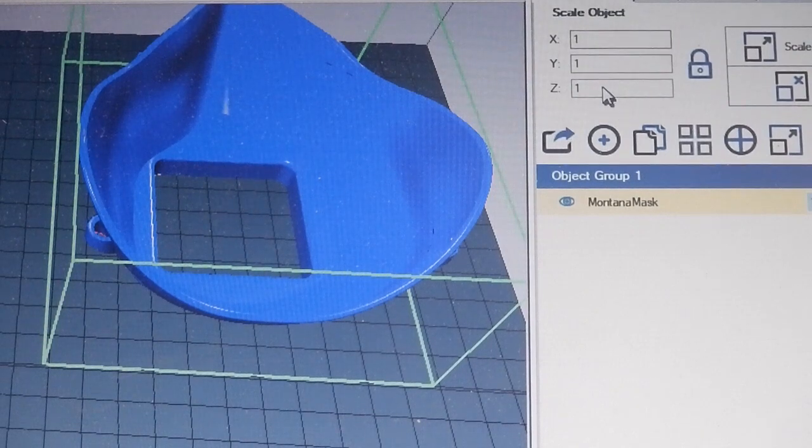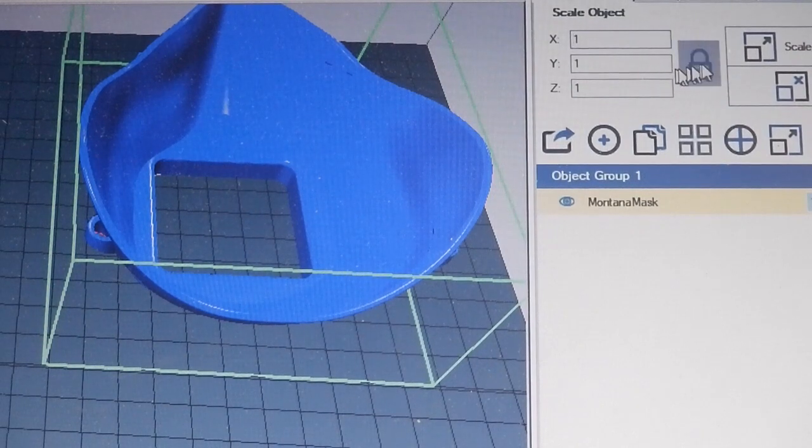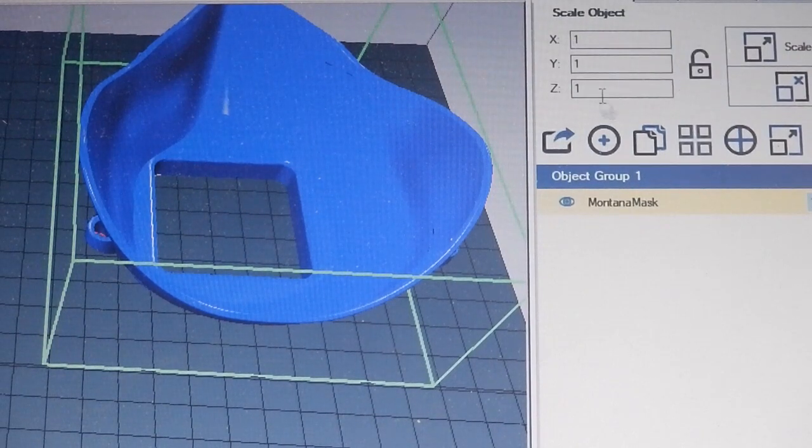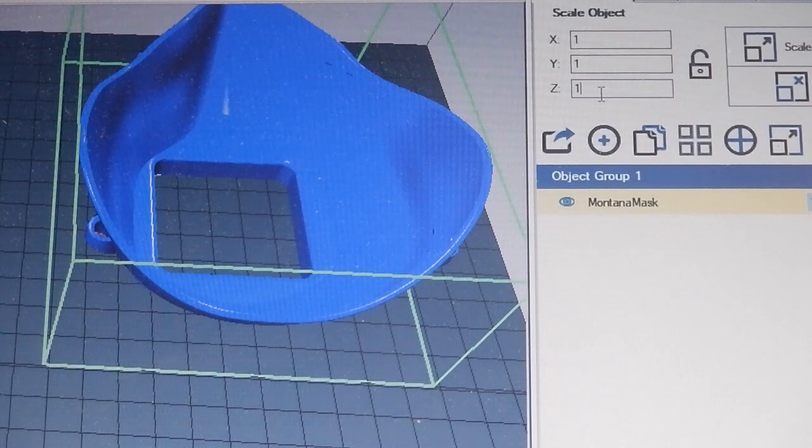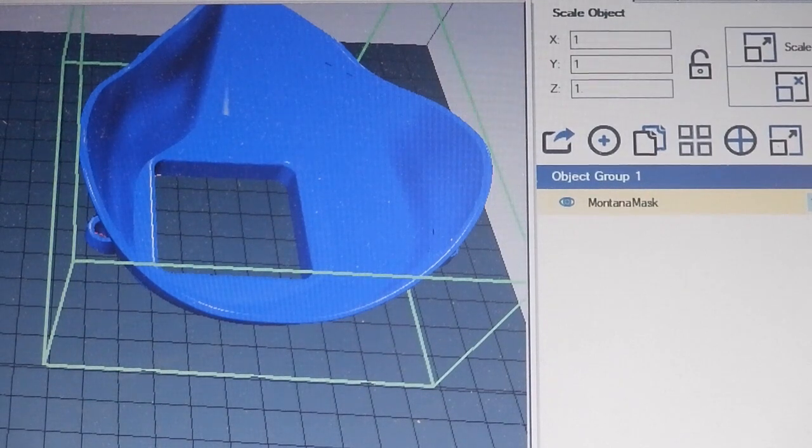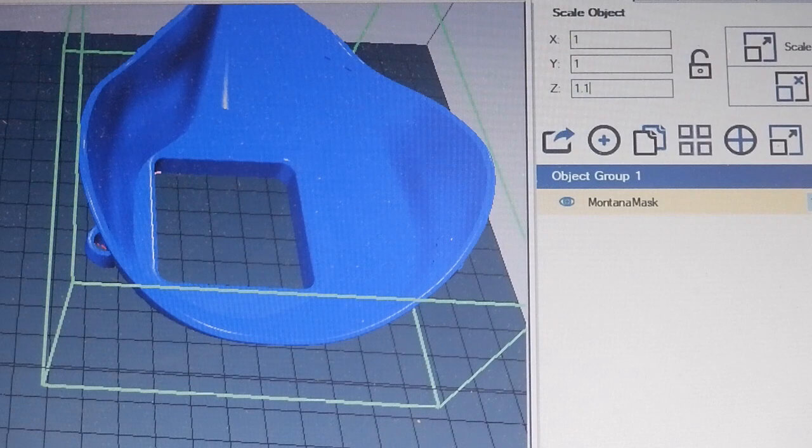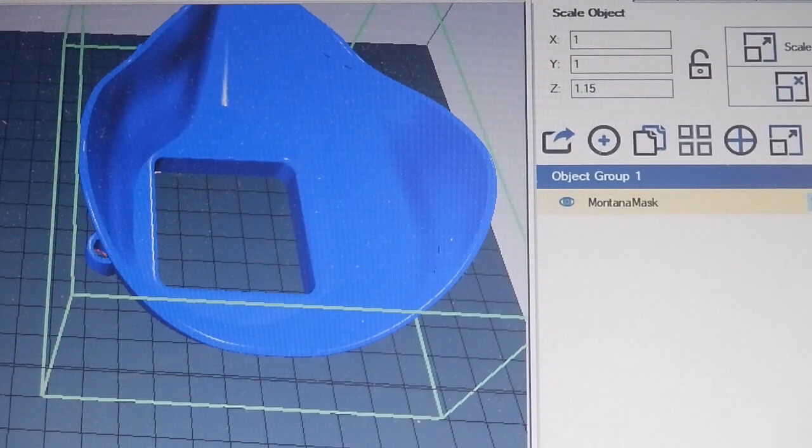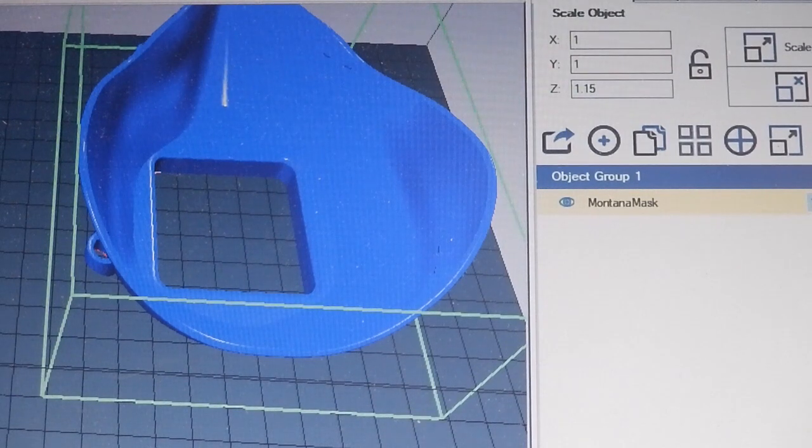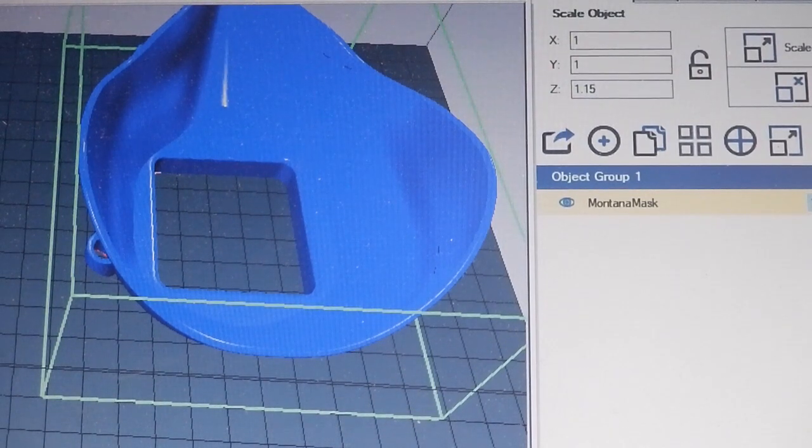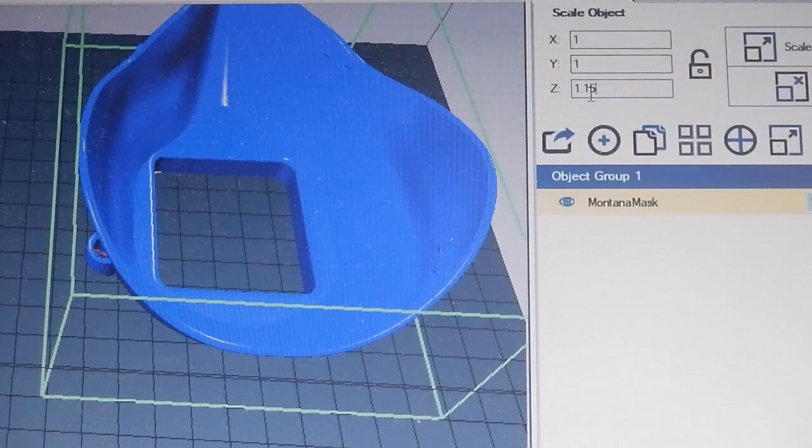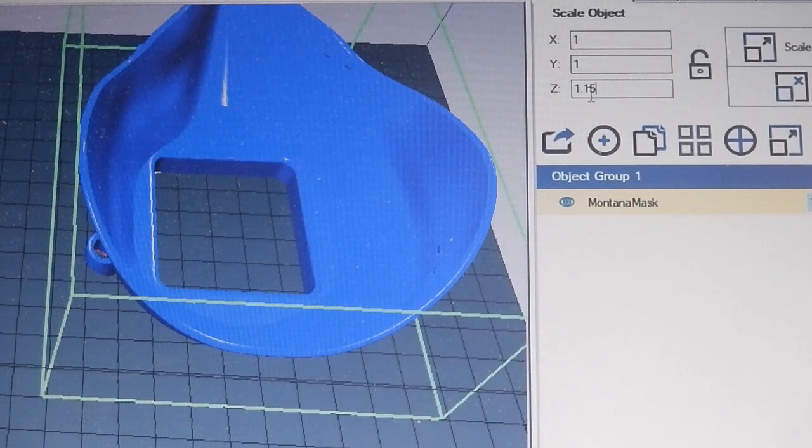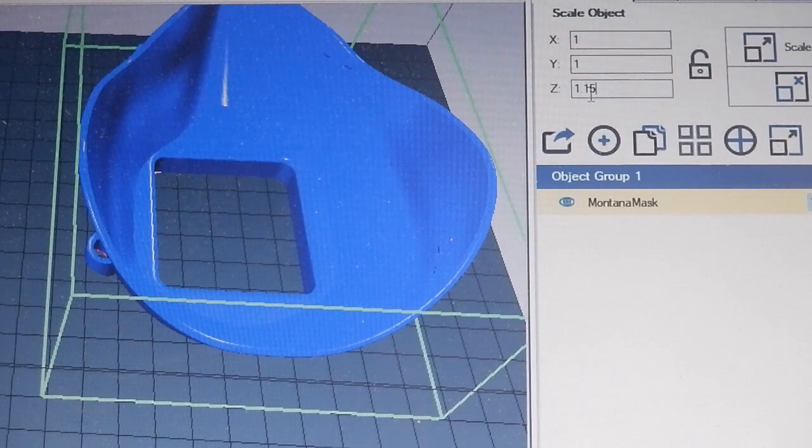On my second print I'm going to stretch it on the Z. I'm going to unlock the Z and stretch it, make it 15% larger, 1.15, to make it a little bit longer but keeping the X and the Y the same.